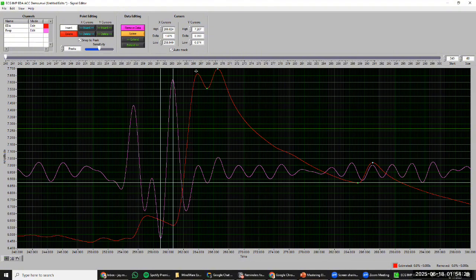You can see here we have what is a compound SCR. They didn't have a recovery point. So this is something that we would also want to investigate due to this respiration, to make sure it's not within that 3 second window, again, 1 to 3. And we can see here it's very far out from that 3 second window, so we can go ahead and leave that one alone.